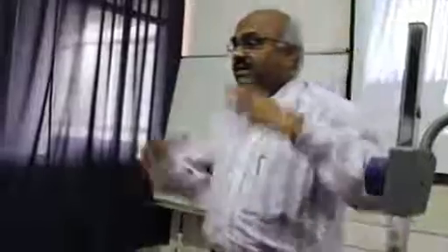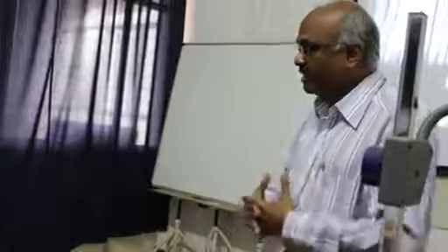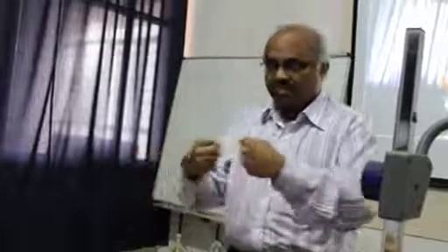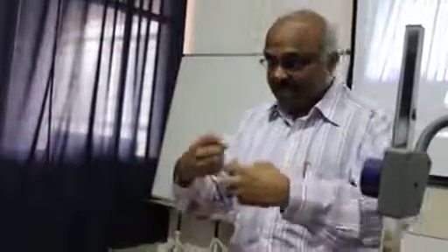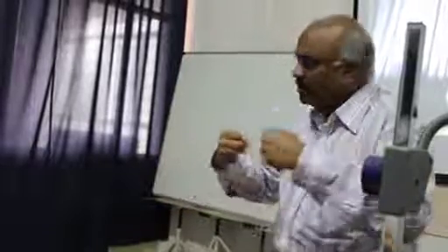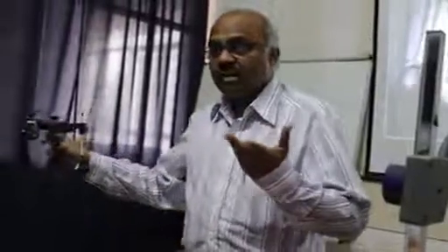The reason behind it is that the whole body, the hard structures, the bones, are supported and function based on the soft tissues like muscles and ligaments. They hold the body, they hold the bones, the muscles and ligaments. They move the bones, they move the joints. Understand? So that is not there here. Do you see muscles and ligaments here? There are no muscles or ligaments here.